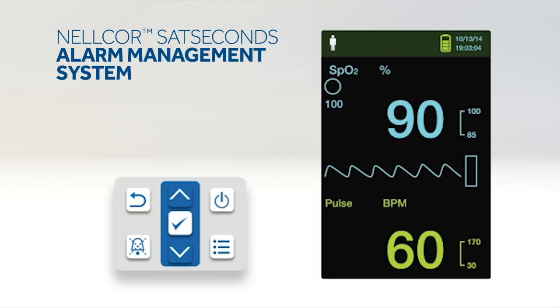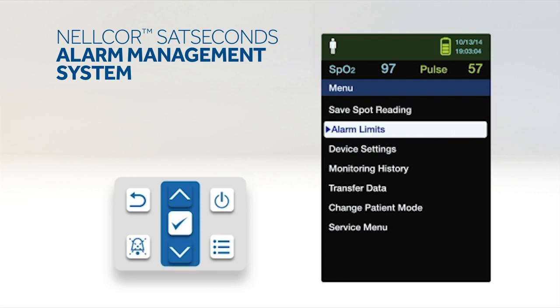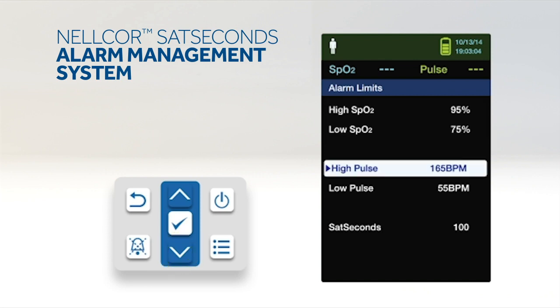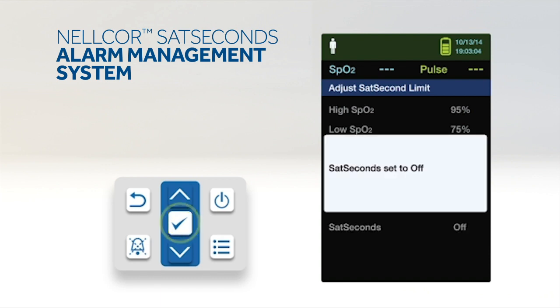To set Nellcor SatSeconds, press the menu button. Press the down button to highlight the alarm limits menu item and press OK to select. On the alarm limits menu, press the down button to highlight SatSeconds. Press the down arrow to change Nellcor SatSeconds to 50, 25, 10, or off. Note that the default value is 100. Press OK to select the value.